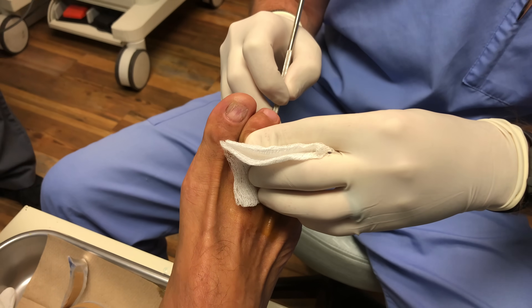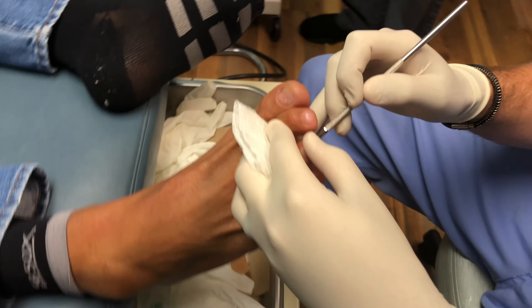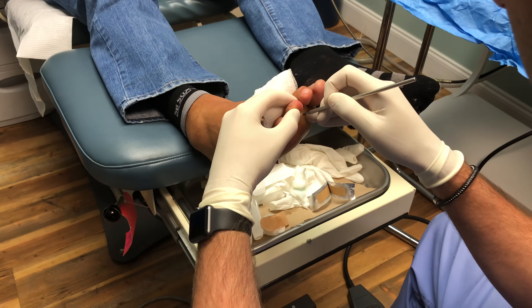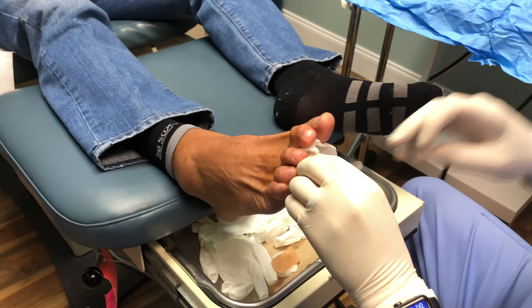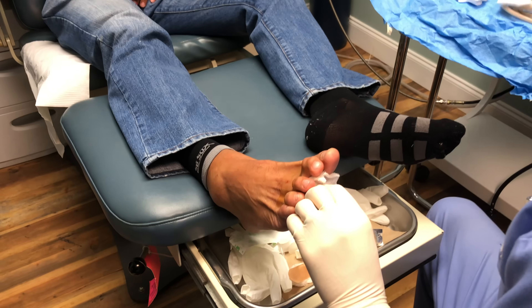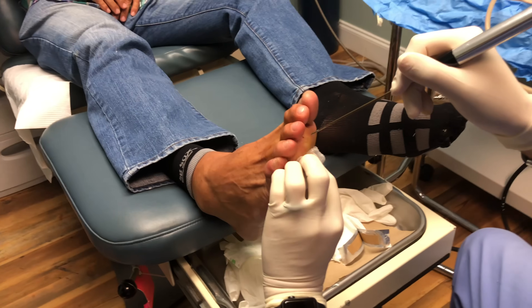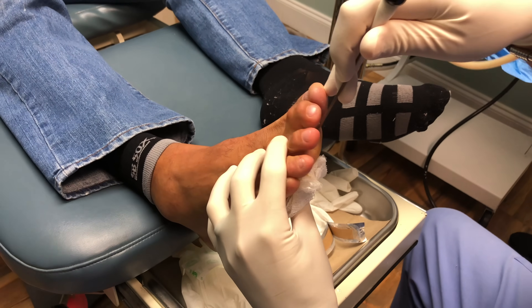Do you feel anything? No. Just a little stab. All right, move this a little closer here. So this is the probe — we're going to go in that little stab incision. And it's just going to be a little bit of resistance at first. Are you doing okay? Good.